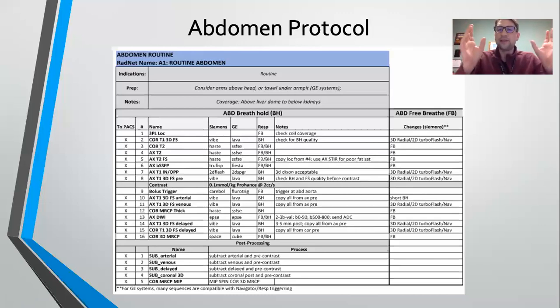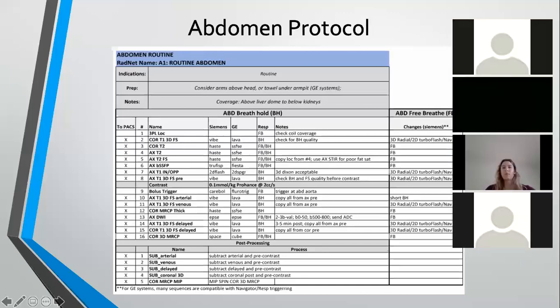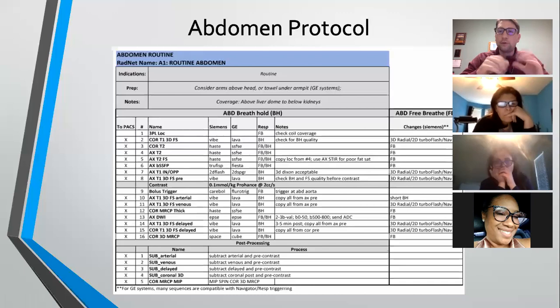Everyone's different. KVO, what does that stand for? Keep vein open. Good, keep vein open. So basically it's just going to be dripping a little bit of saline into that IV that you started. It keeps the vein open. So when you inject that bolus of contrast, it doesn't really shock the vein, because if you have a little bit of fluid already flowing in there, it's less likely to blow the vein.